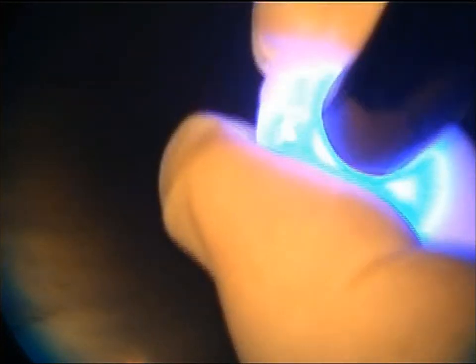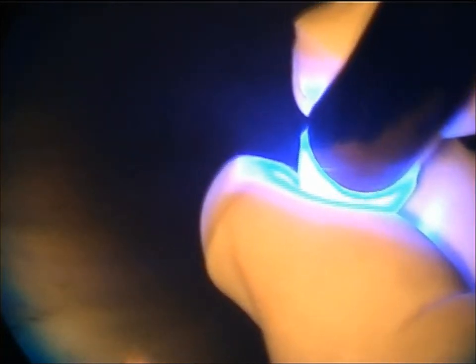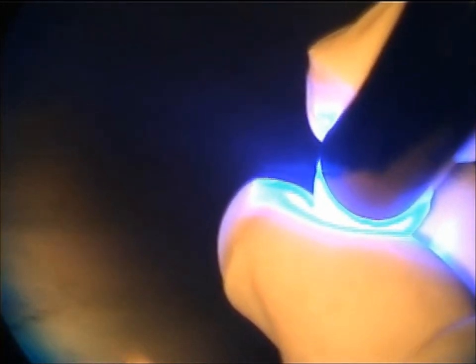And I'm gonna light cure for 40 seconds, because when you work with the tints, we need to put a little more light when you light cure. So if you use, for example, 20 seconds for a composite resin, you should use at least 40 seconds for a composite resin tint. The difference of this material compared with ceramic: for ceramic, if you want to add stains, you need a furnace, and to put the restoration in the furnace. So with this material, you don't need any furnace, you just work with it like a composite, like if you make a direct composite resin restoration, it's the same way. Okay, so it's done, you can see.